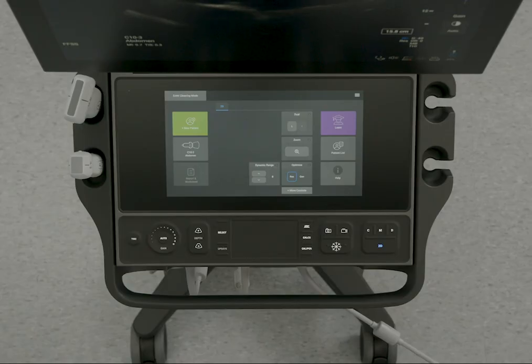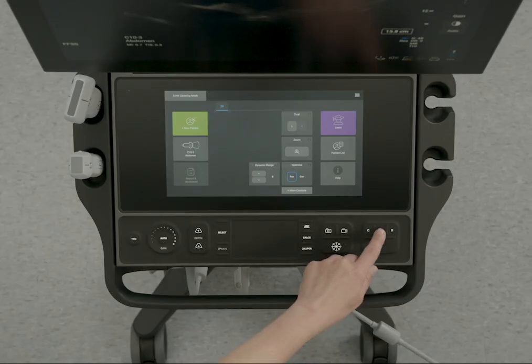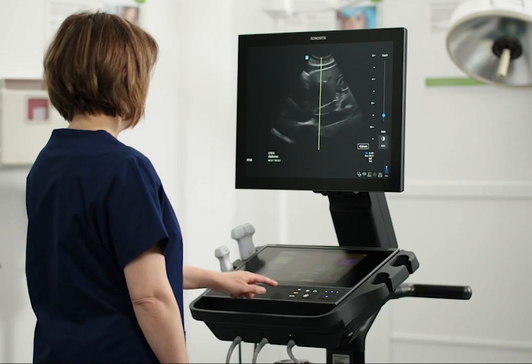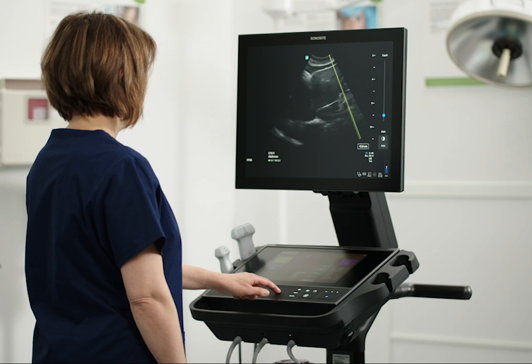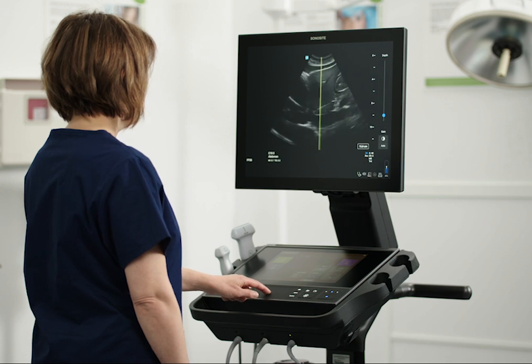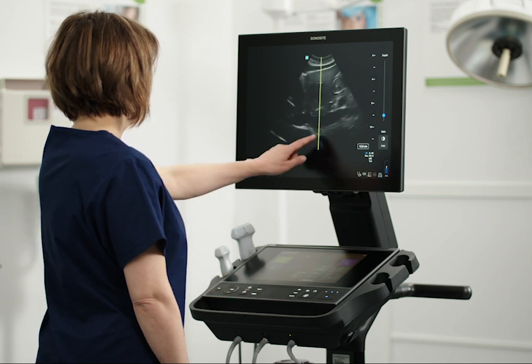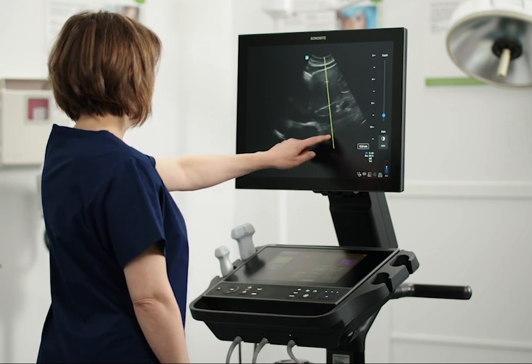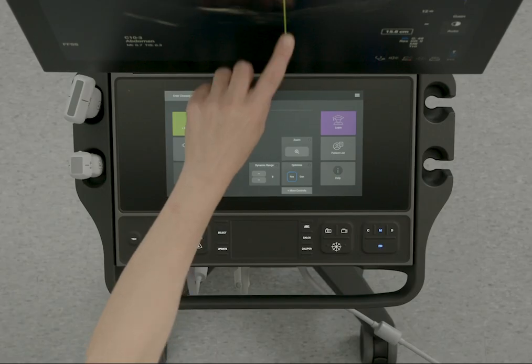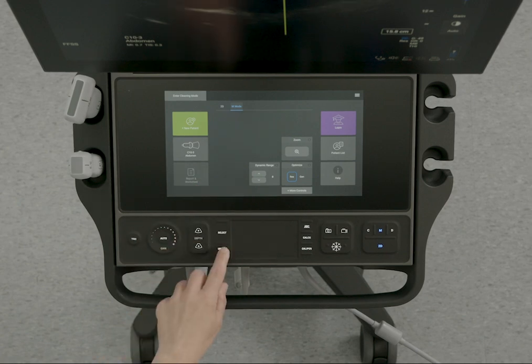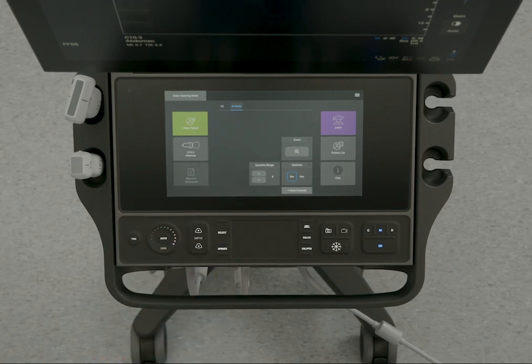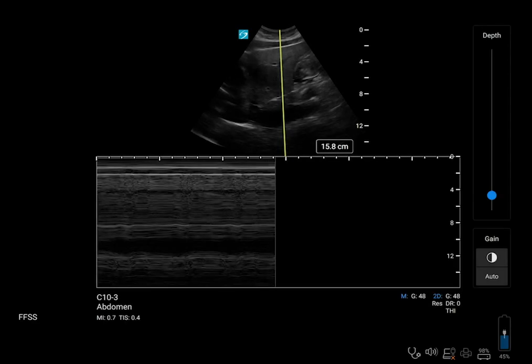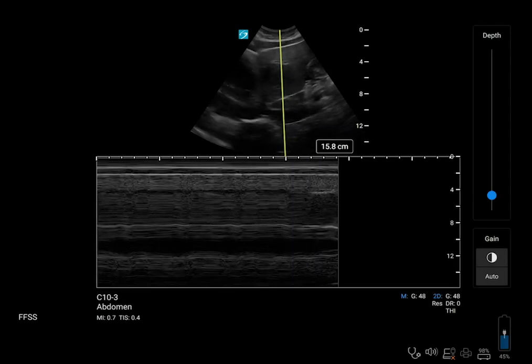Now let's change to M mode, which provides a trace of the 2D image displayed over time. Slide the M line to the desired spot on the screen using the touchpad or touchscreen, and then press the Update control to activate.